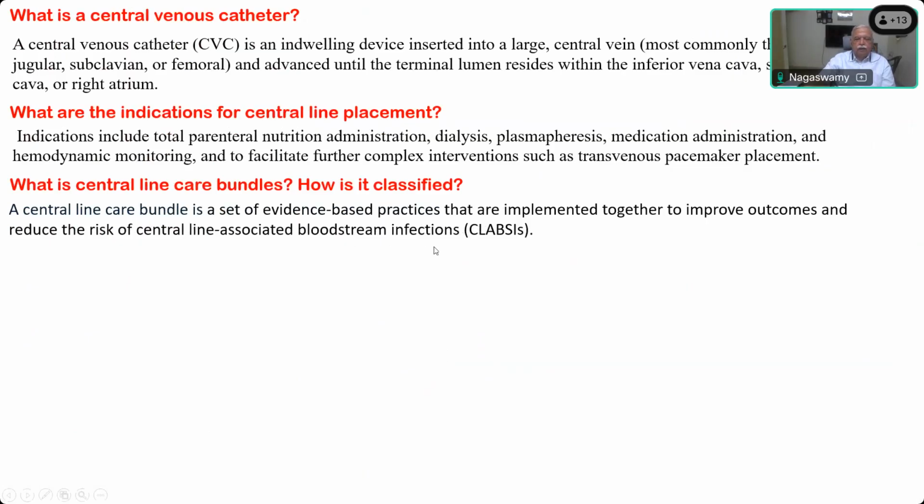So that is why they say you have to wash, scrub nicely, wear your gown, gloves, mask and cap also. In fact, they say an ICU or trained nurse should monitor when a person is doing the central line insertion. And if the person is going in the wrong direction or into a faulty vessel, what should be the shouting by the monitoring nurse?